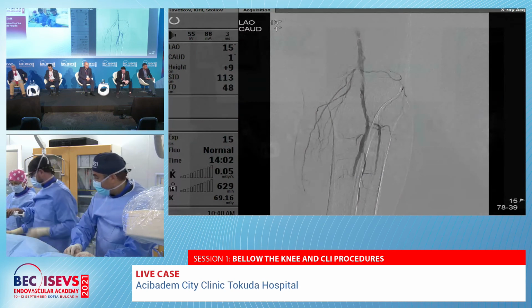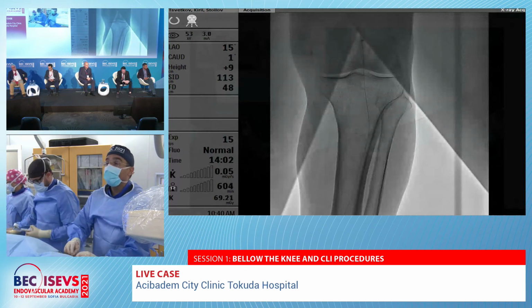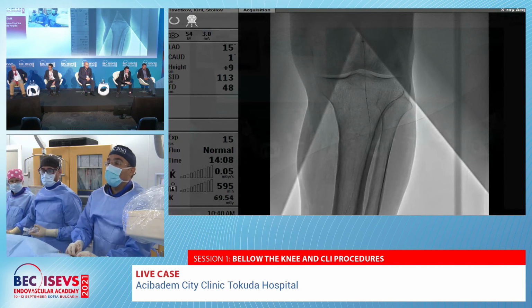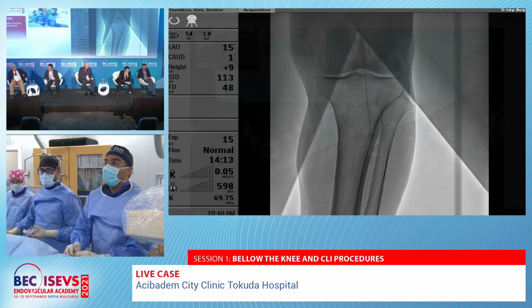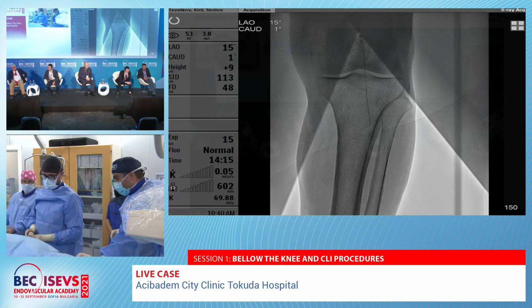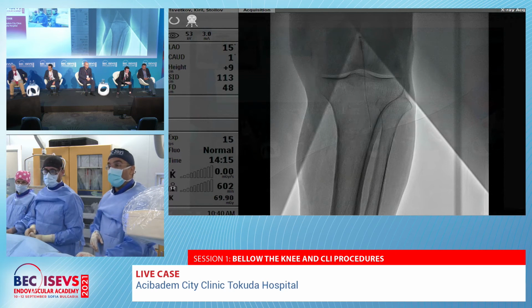Theo, short question. If you have to stent, what kind would you use? Well, actually, everyone would say here Supera. But I would not agree with this. In my opinion, there are very good stents, and due to the fact that the Supera has problems with opening due to the fibrotic lesion from the endarterectomy, I will use a classical bare metal stent here. But we will see.